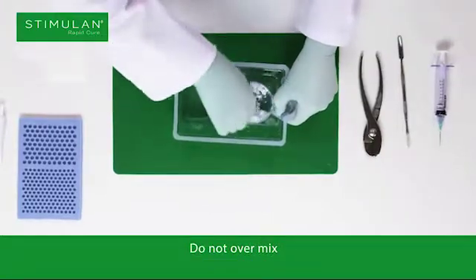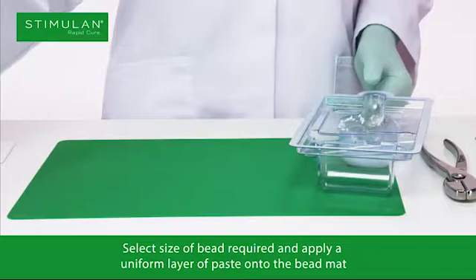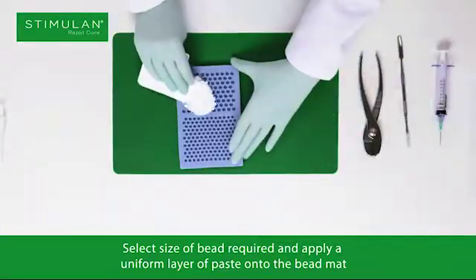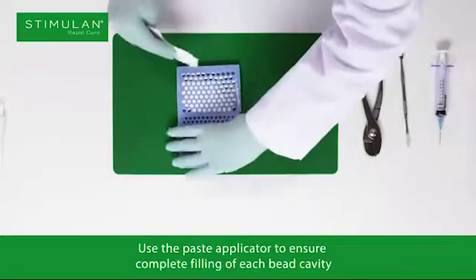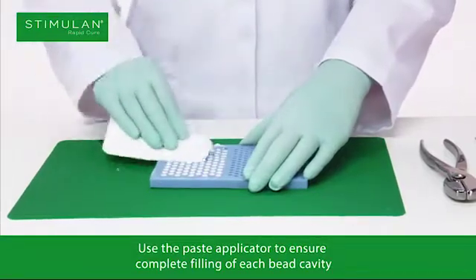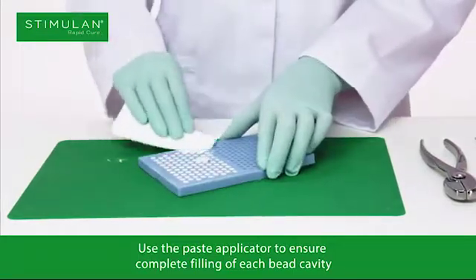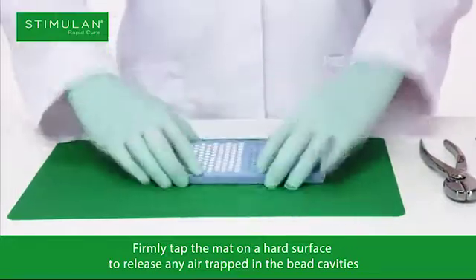Mix thoroughly for approximately 30 seconds until a smooth paste is formed. Do not over mix. Select the size of bead required and apply a uniform layer of paste onto the bead mat. Use the paste applicator to ensure complete filling of each bead cavity.